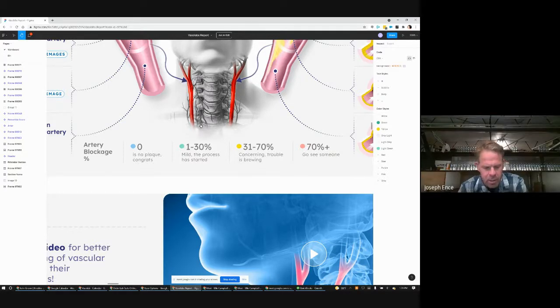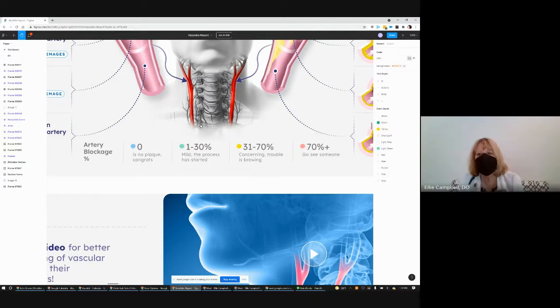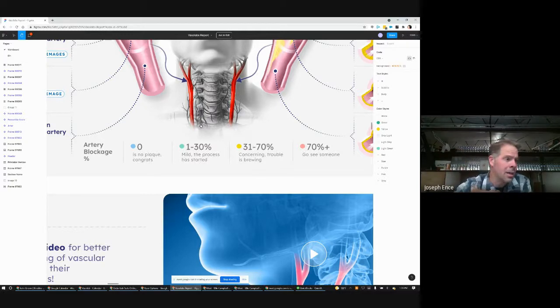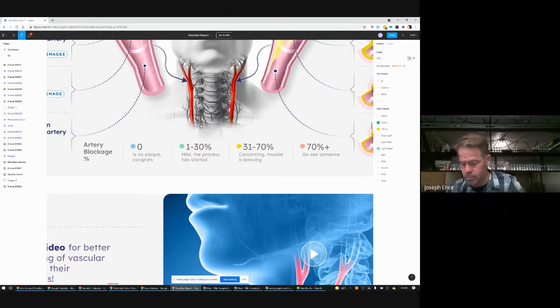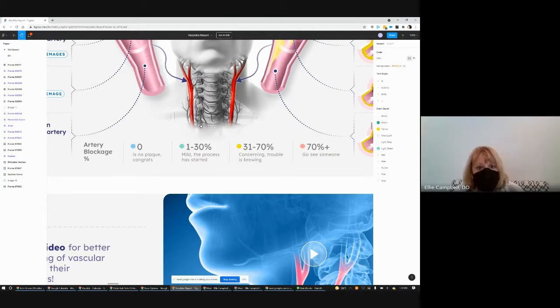We've been talking about them lately, how they tell me their cone beam x-rays could find so much more carotid and vascular disease if that wasn't coned out. Oh, interesting. And now we're talking about that with my tests. Do we report thyroid issues if the tech sees it? And do we even need space for it? Because of that liability, these are crazy. I want to tell everybody, but it's going to kick up a bunch of work for you if I report every nodule. Yeah, well, sub-centimeter nodules don't require an evaluation. They just require watching. Correct. But I want to know if they're there.